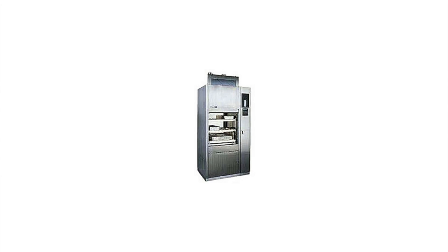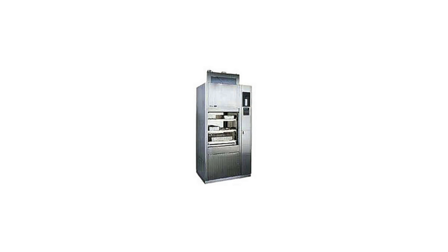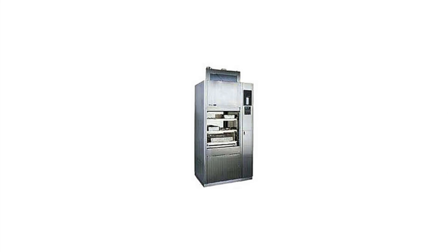The Steris Reliance 444 is a single chamber mechanical washer and disinfector. The Steris 444 is equipped with an Eagle 3000 Stage 3 control system.